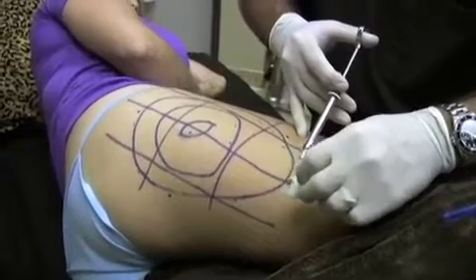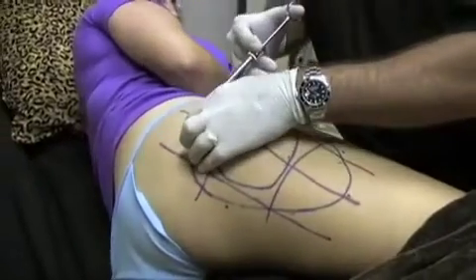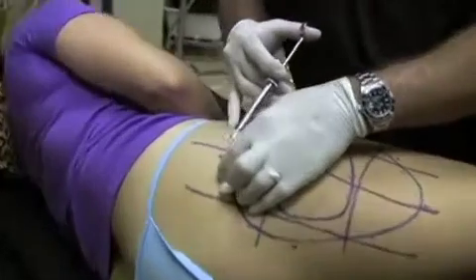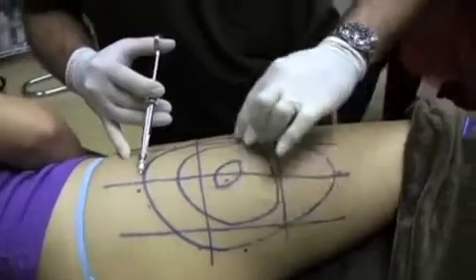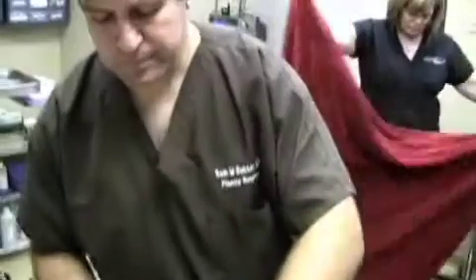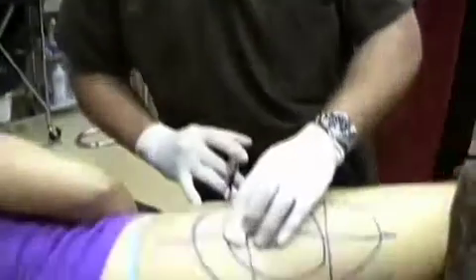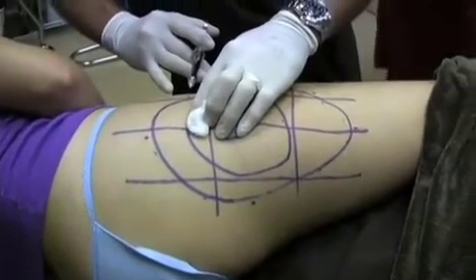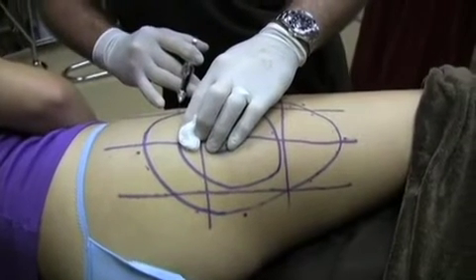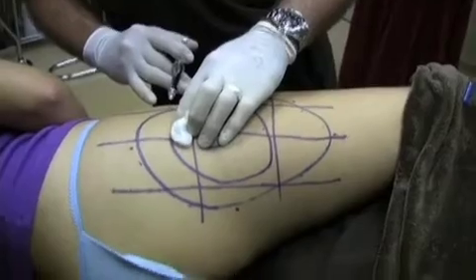This is to numb the area? This is to numb the area, the initial area. And then I inject through the area that's been numbed, and we slowly infiltrate the entire area. We'll start off very slowly with the medicine to minimize any pinching sensation. And then as we start getting it numb, we'll increase the flow rate, and we'll show the pump that we use in just a minute.